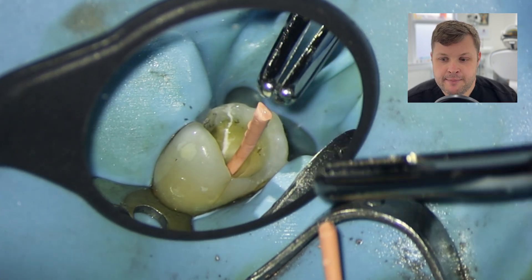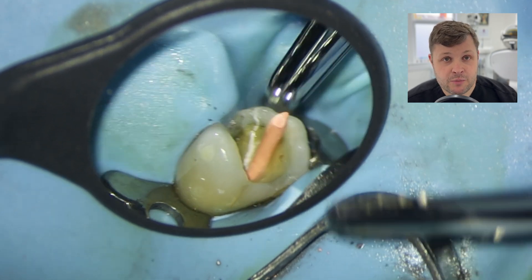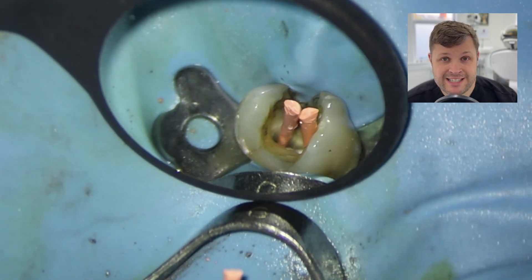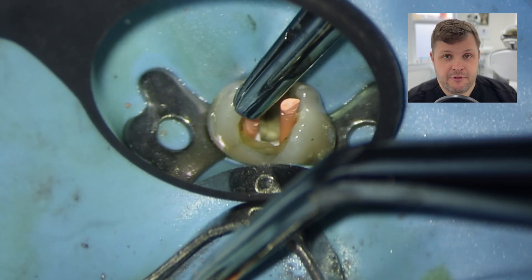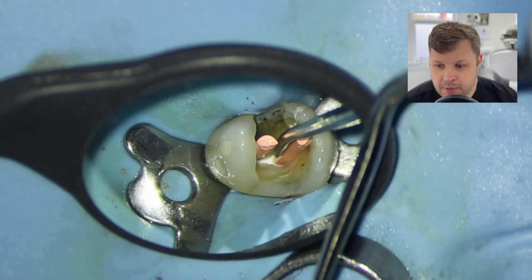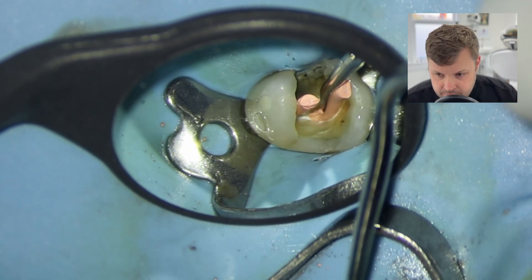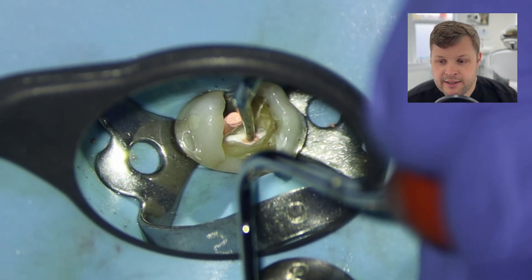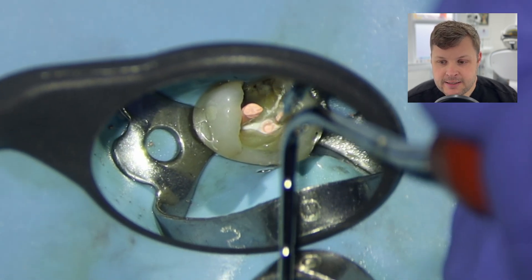I very gently push the GP to length. Venting the sealer isn't much of an issue here because of the extra canal. In this case I fit both GP points at the same time — sometimes I'd fit one, burn it off, push it down, then fit the other, but here it felt easier to do both simultaneously. I then use a heated plugger to burn off the excess and Mach 2 pluggers to push down firmly.